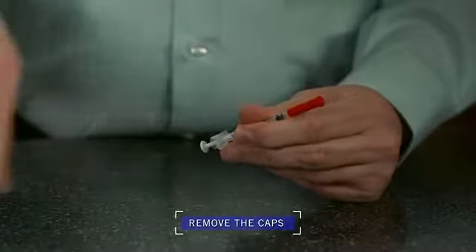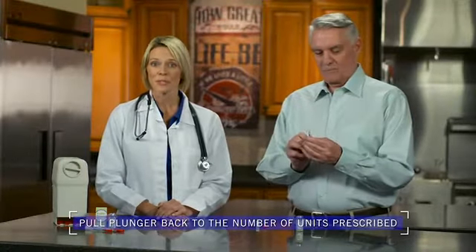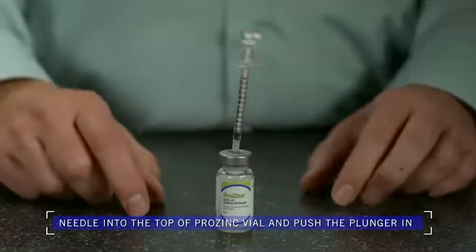Now take the syringe and remove the caps from the plunger and the needle. Pull the plunger back to the number of units your veterinarian prescribed for your cat. Charlie was prescribed four units of Prozinc, so Tom will pull the plunger back to the four unit mark. Now you're going to stick the needle into the top of the Prozinc vial and push the plunger all the way in to inject air into the vial.